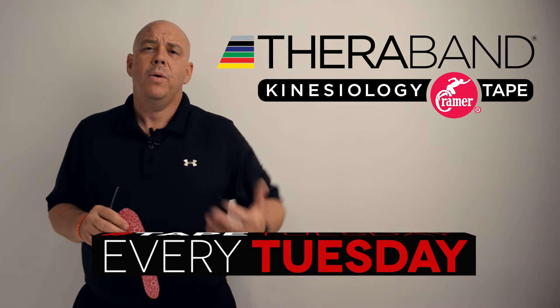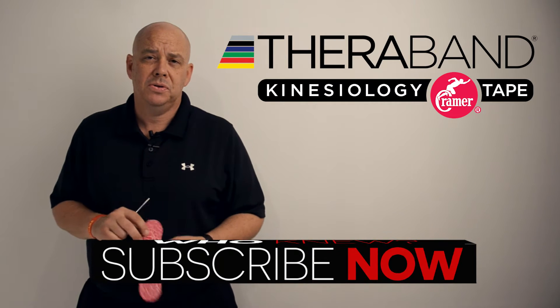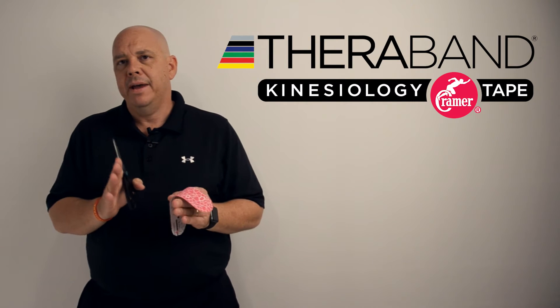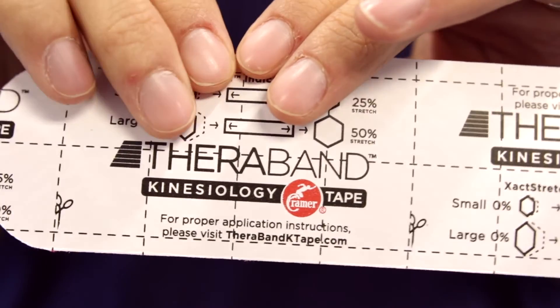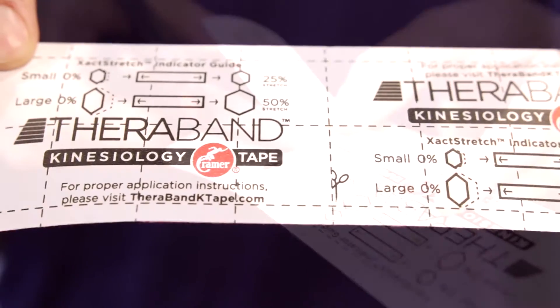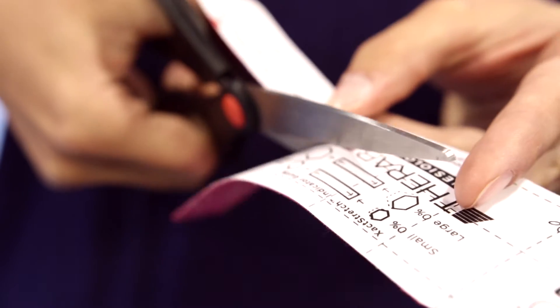The next cut I'll demonstrate is the Y cut — it's probably the second most used cut you'll see. We generally use a Y cut when we have a larger area that we want to cover. I've already started with my I cut, and what I'm going to do now is cut down the middle of the tape.